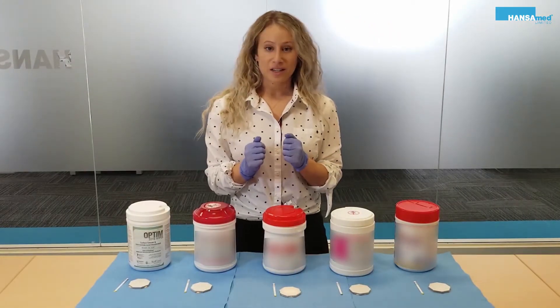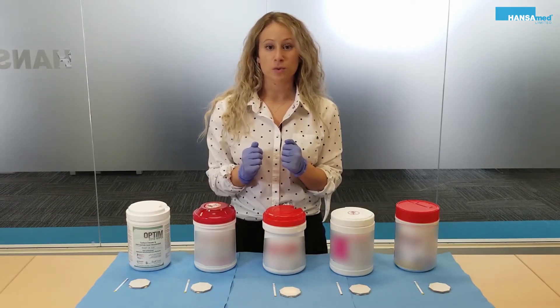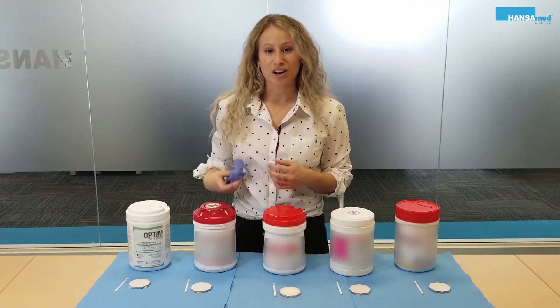This concludes today's cleaning efficacy test. As you can see, the results were obvious. For more information about OPTIM Wipes, visit us online at www.hansamed.net.